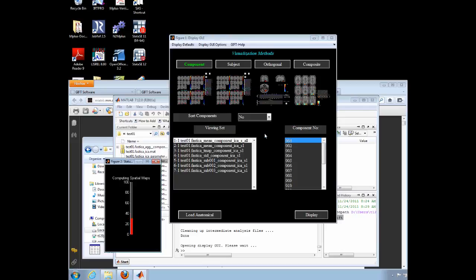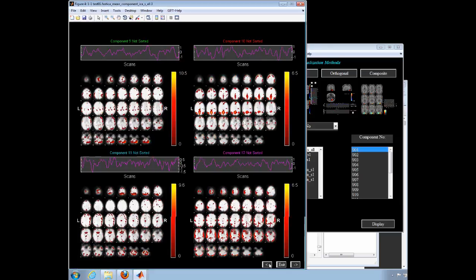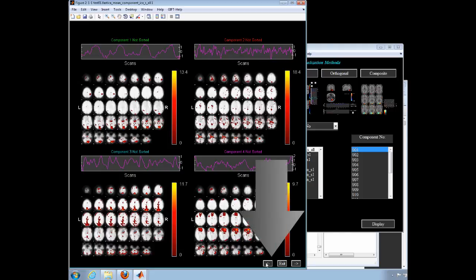Select the mean at the top of the list, then click Display. A series of windows with 4 subjects per window will appear, but you can jump from one to the other simply by clicking the arrows at the bottom of any of the windows.